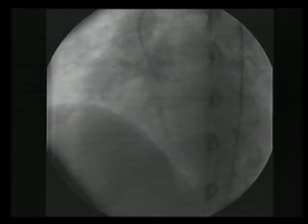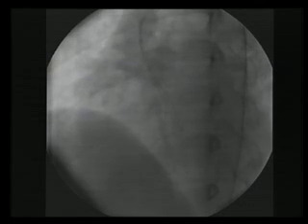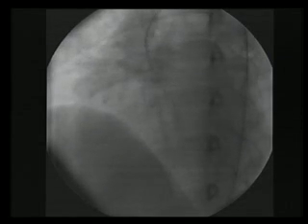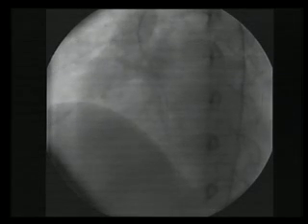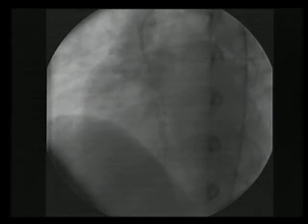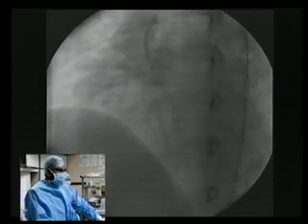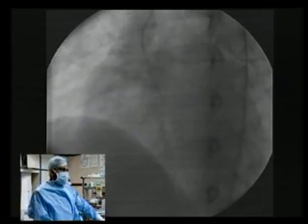We actually pull back the wire close to the muscular VSD or membranous VSD, wherever the VSD is. Then naturally the glide wire will float into the right ventricle along with the left-right shunt. So you can see that this will take just less than a minute, and once you are comfortable in negotiating the wire, either you can park the wire in the right ventricular apex like in this case, because of the jet, or it will go to the pulmonary artery.